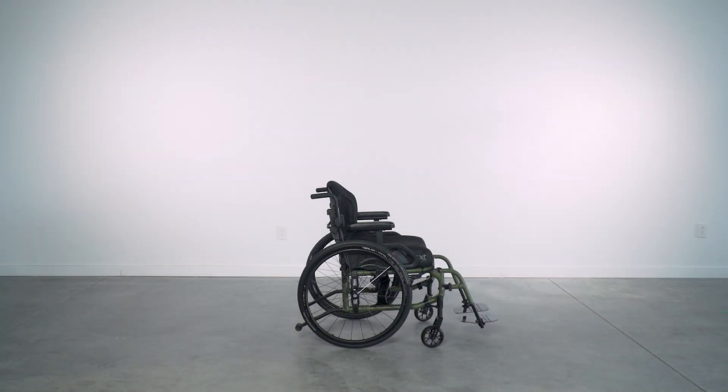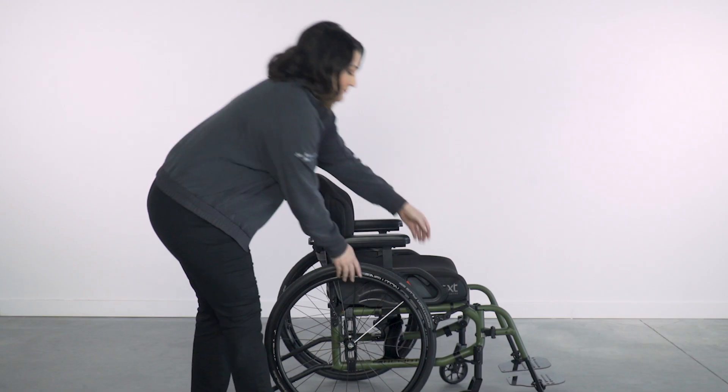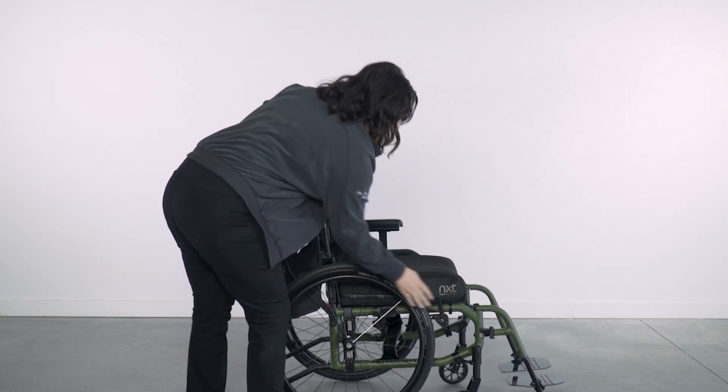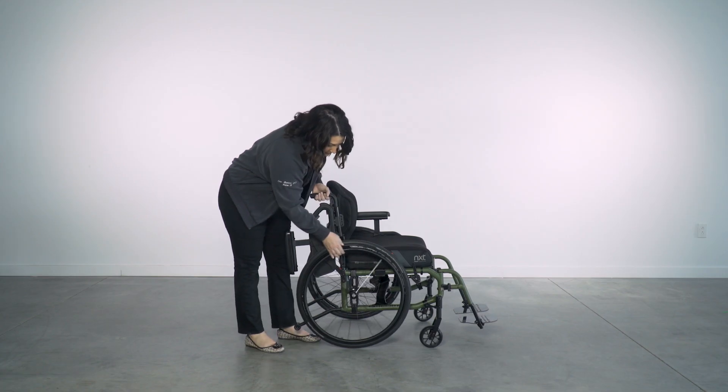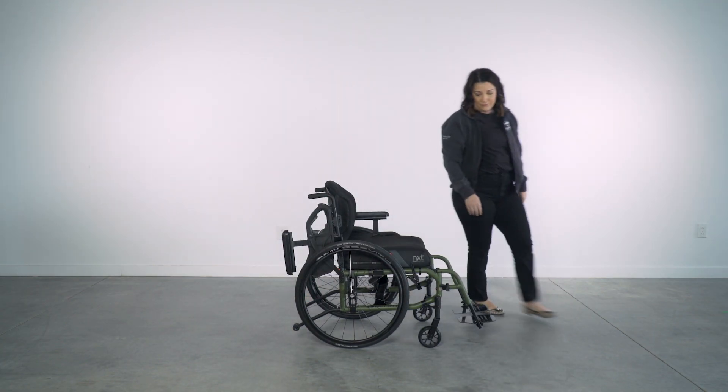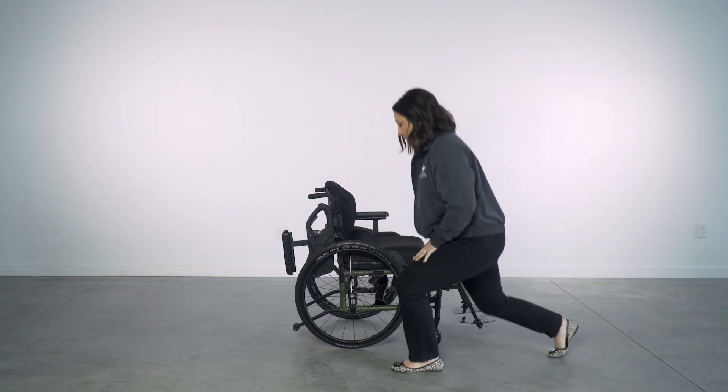Here we will review horizontal and vertical rear wheel placement to determine the ideal setup for a client. Horizontal rear wheel placement refers to center of gravity, and vertical wheel placement will affect shoulder ergonomics, impacting overall maneuverability and playing a significant role in client satisfaction.